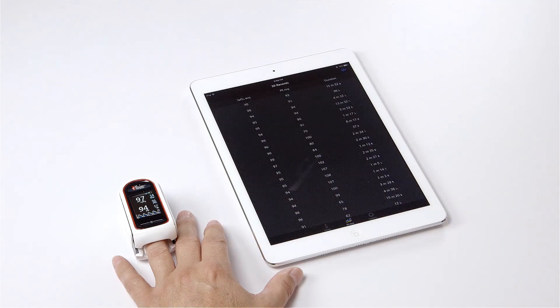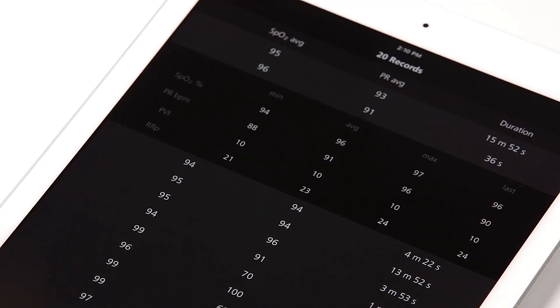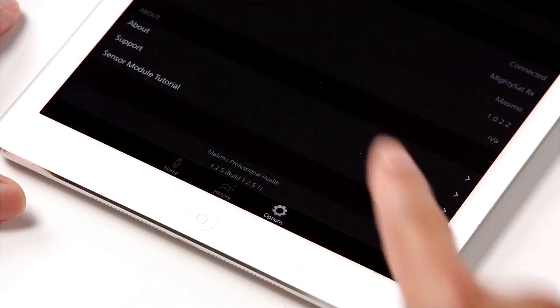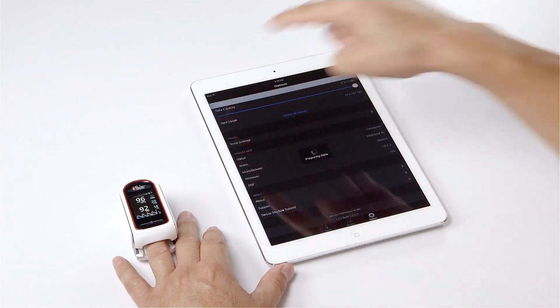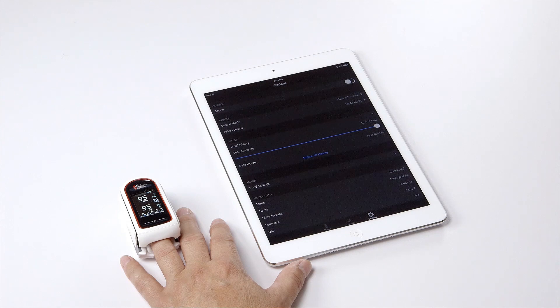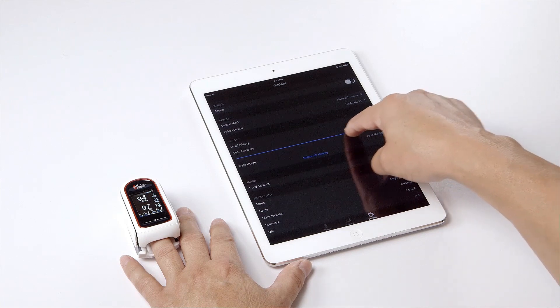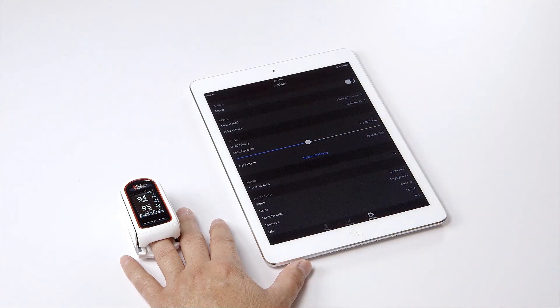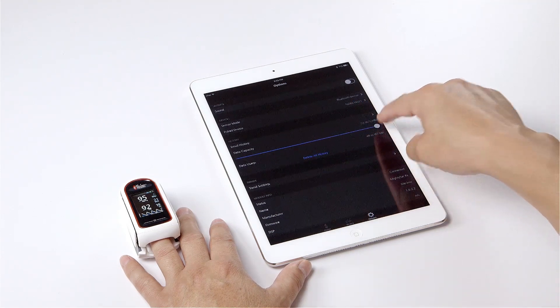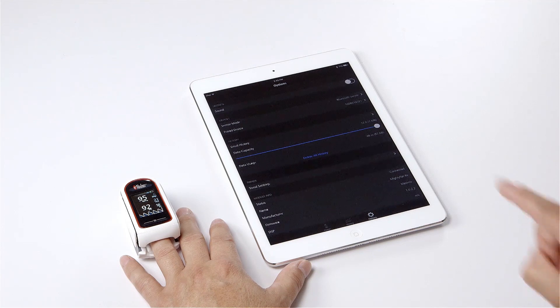Tap on any individual record to see additional detailed information including minimum, average, maximum, and last readings for SpO2, PR, PVI, and RRP. Tap the options icon and tap email history to send the data of the selected record via email. To increase or decrease the timescale for recorded measurements, swipe the blue slider to change the data capacity. To delete any file, just tap on delete all history.